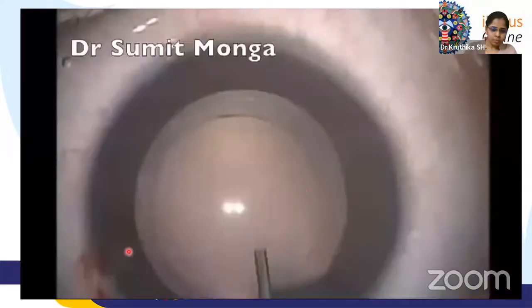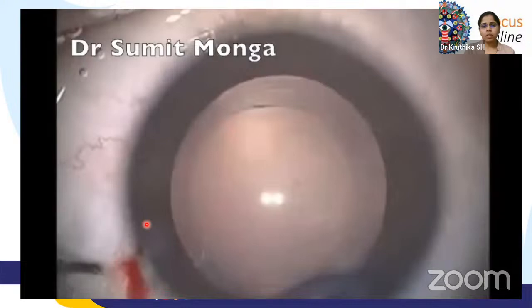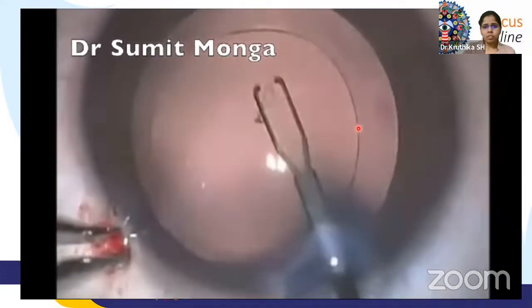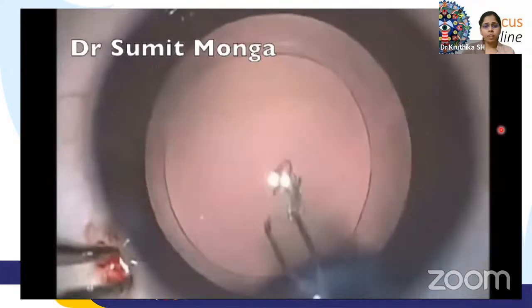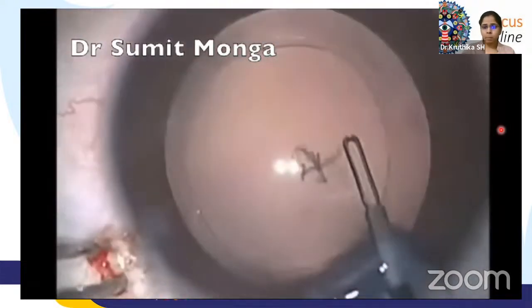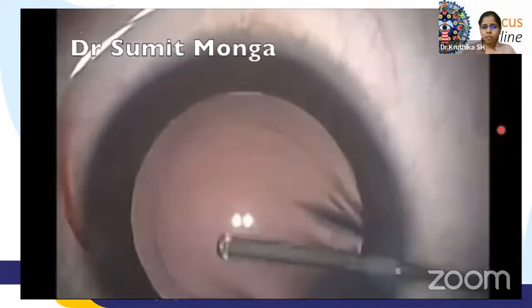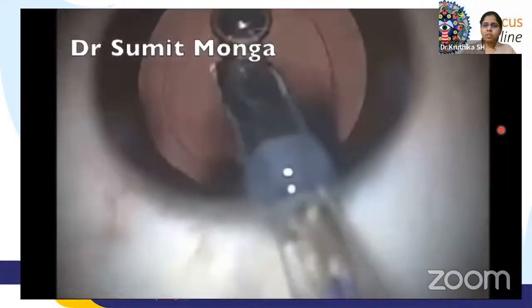This is a surgical video showing posterior capsulotomy. The surgery was performed by one of our senior consultants at Center for Sight Eye Hospital, Dr. Sumit Monga. As we can see here, after aspiration of all the lens material, sir has made a nick on the posterior capsule, after which the capsule is held with a forceps and a controlled tractional movement is done to complete a capsulorhexis. As we can see, a well-centered, smaller size posterior capsulorhexis is performed, after which we can even inject viscoelastic substance in the Berger space, following which anterior vitrectomy is performed. The capsular bag is inflated adequately with viscoelastic substance, and then the IOL is placed in the bag.